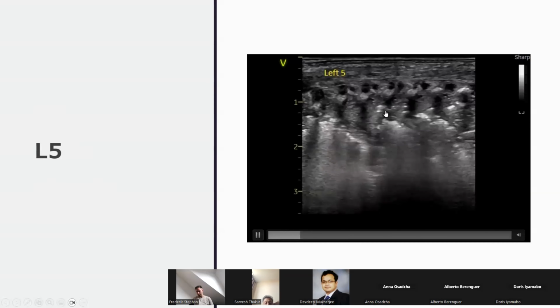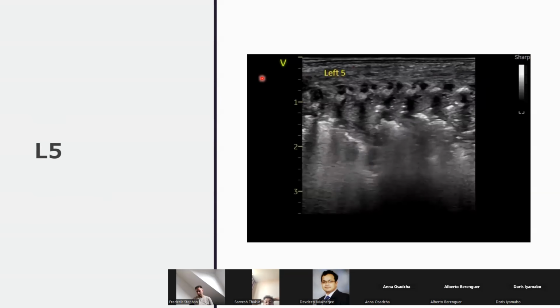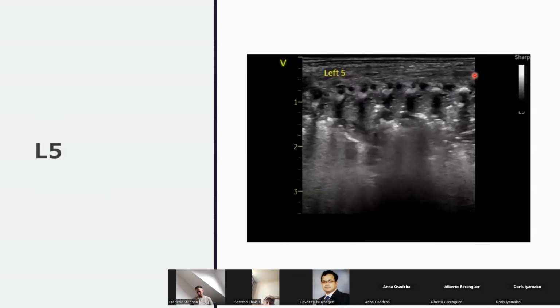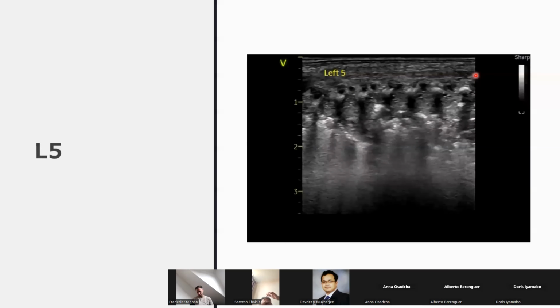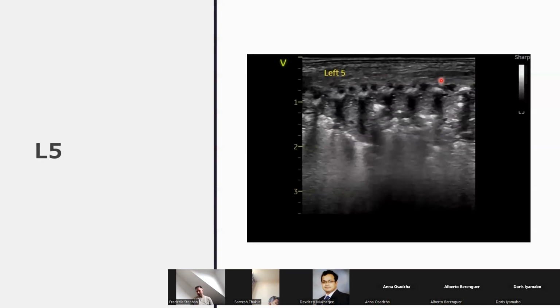I think where Satish is slightly worried is, and I'm just going to highlight it here. So going by protocol, soft tissue, ribs, batwing sign. Now, just for everybody's knowledge, the view I'm using at the moment using a linear probe is what is called extended convex view. It means I can see virtually the whole of the back in one view, and it's available on the Sonosite and on the GE. It's really good because in an acute situation, I don't want to handle this baby too much by going into each individual space, taking two or three spaces at a time.